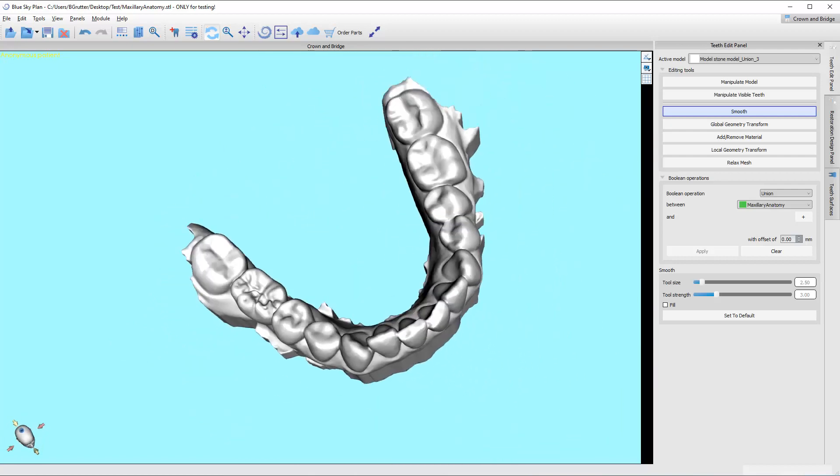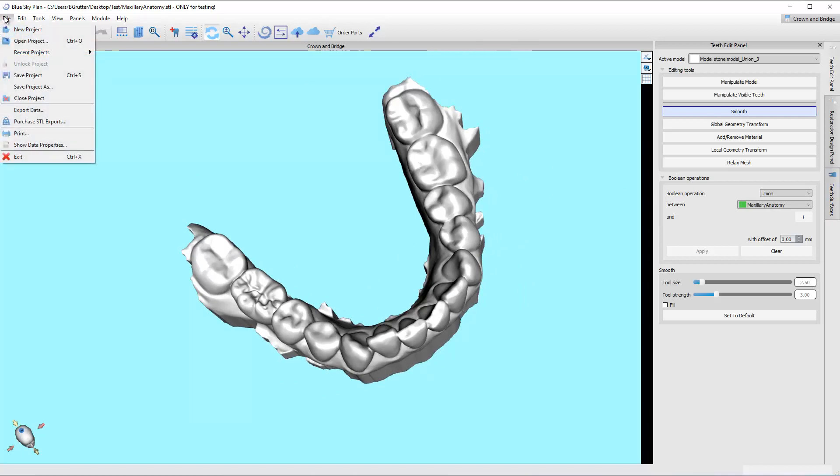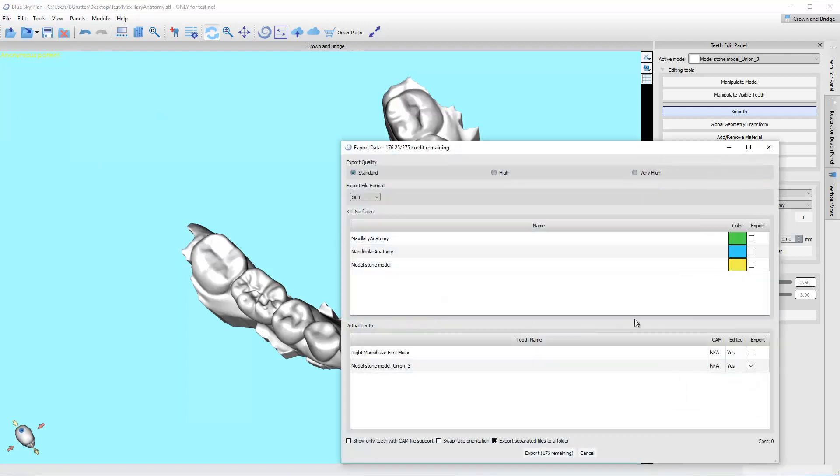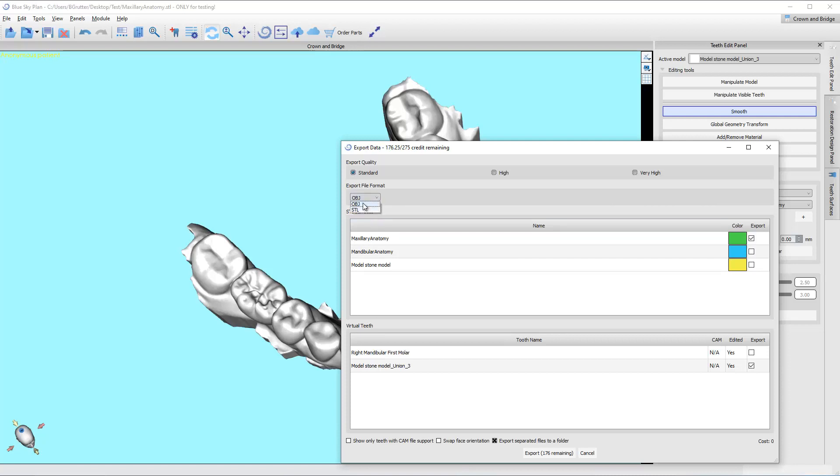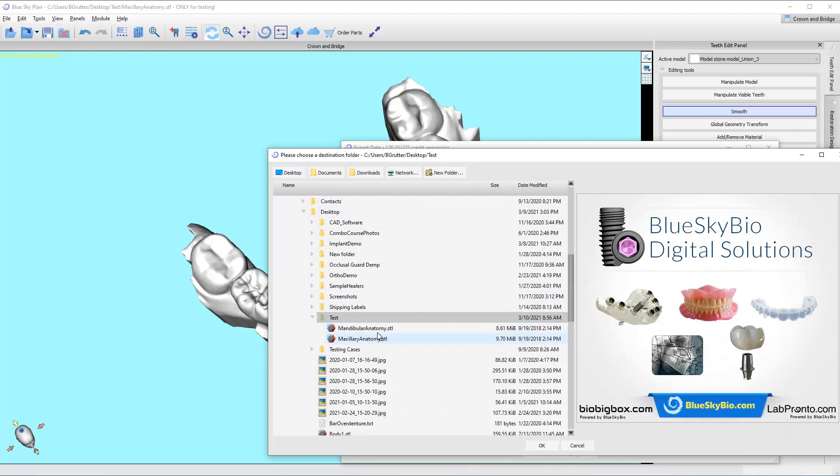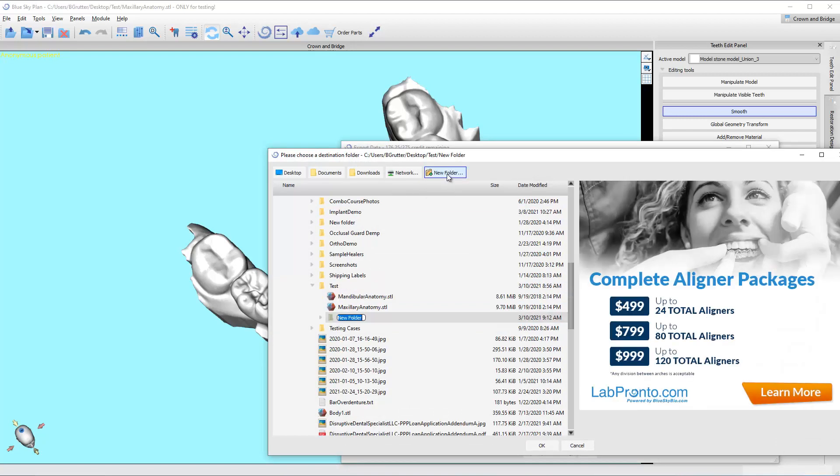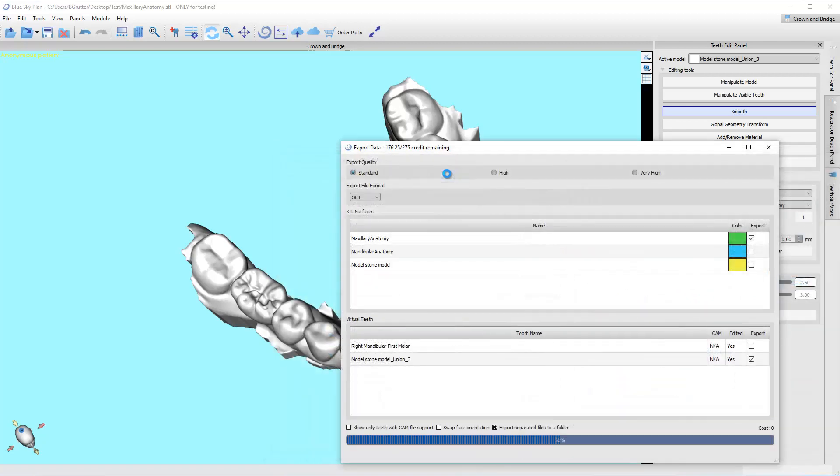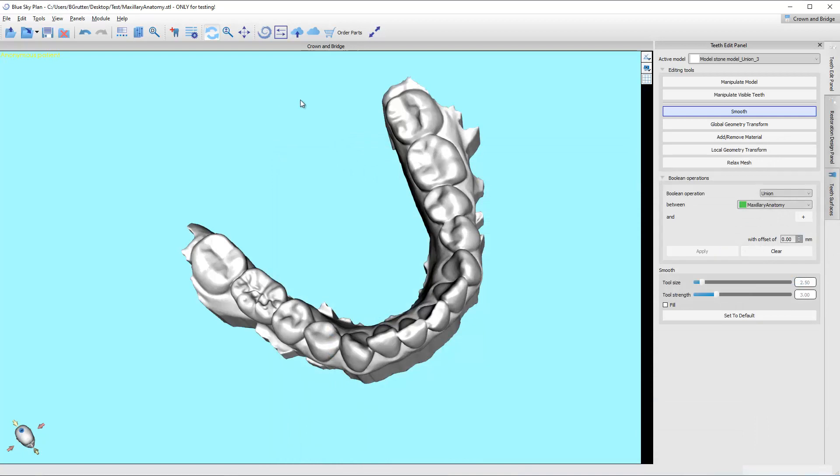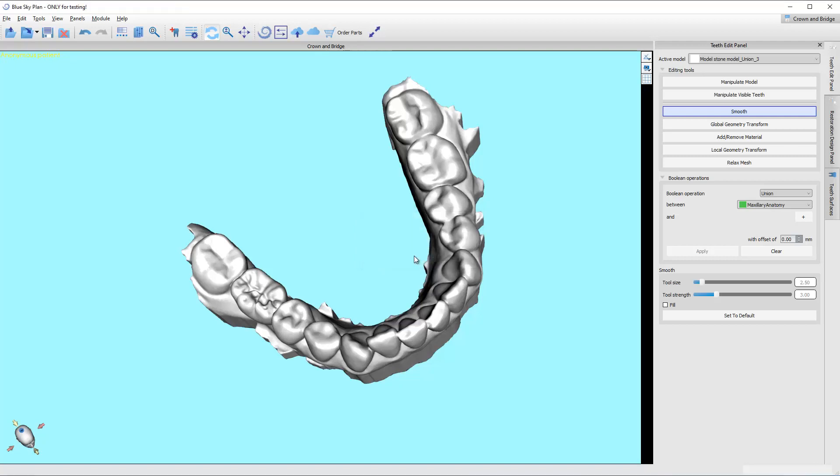How do we get this model out? We need to come up here. And we need to say export data. So, we've got this model. We also want to export the maxillary anatomy because that was that one we kept around just in case we would need it down the road. I'm exporting it as an OBJ. You can always change to STL if you want. Make sure that this box right here is export separated files to a folder. You want separate files. Otherwise, it'll be both the maxillary and the mandibular arch as one. So, I'm going to say, let's call this modified models. And it's exporting.